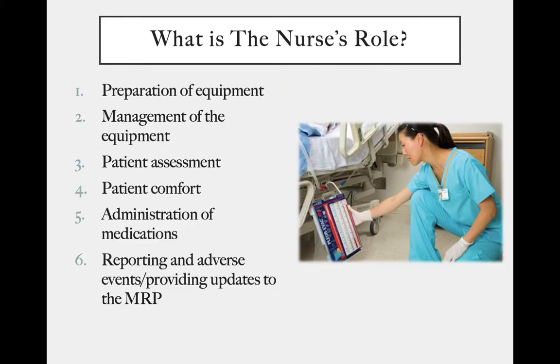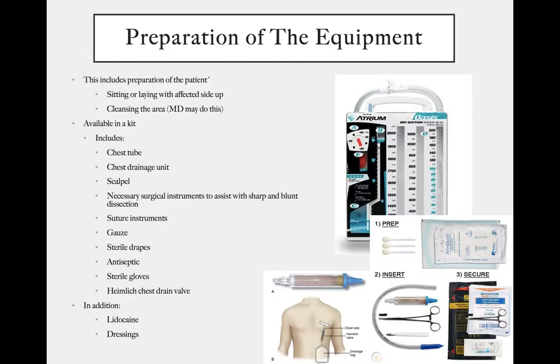So what is the nurse's role in all of this? They're involved in the preparation of equipment, management of the equipment, assessment of the patient, providing comfort to the patient, administering medications, and reporting and monitoring adverse events, and providing updates to the most responsible physician. So preparation of the equipment also involves preparation of the patient, so having the patient in that sitting or lying position with the affected side up, cleansing the area. The doctor may also want to do this, it just depends on their preferences, and then actually getting the equipment available for the physician. So oftentimes this is available in a kit.